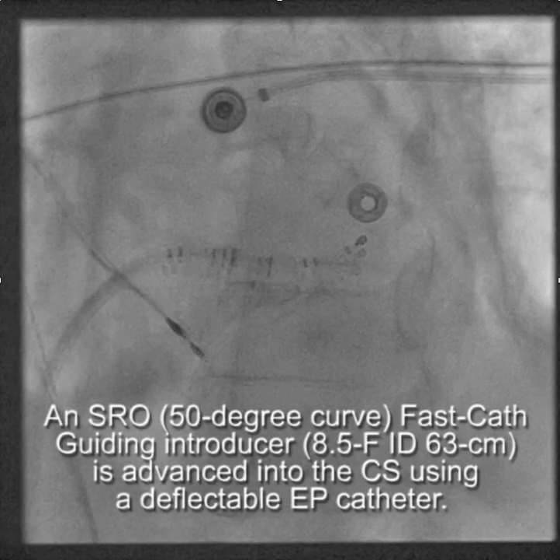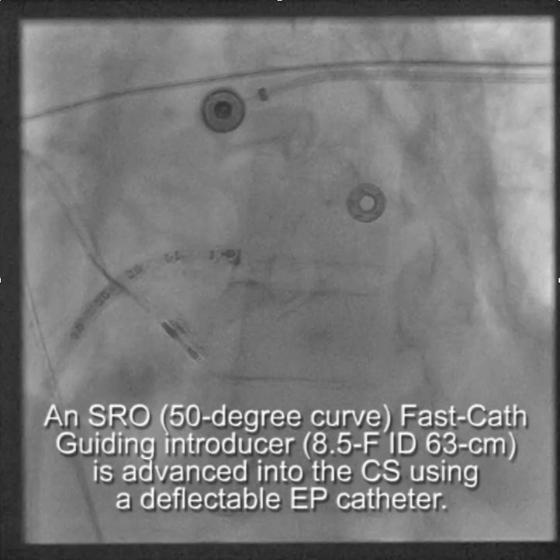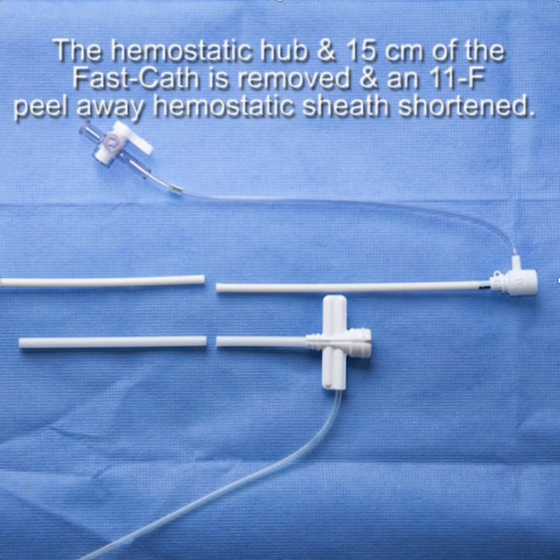From there we went with the SRO 50-degree curve, 8.5 French internal diameter, 63 centimeter, and we advanced that into the coronary sinus using a deflectable EP catheter. Now we have the SRO in the coronary sinus. The key is to be able to put the LV lead in and still be able to remove the SRO.